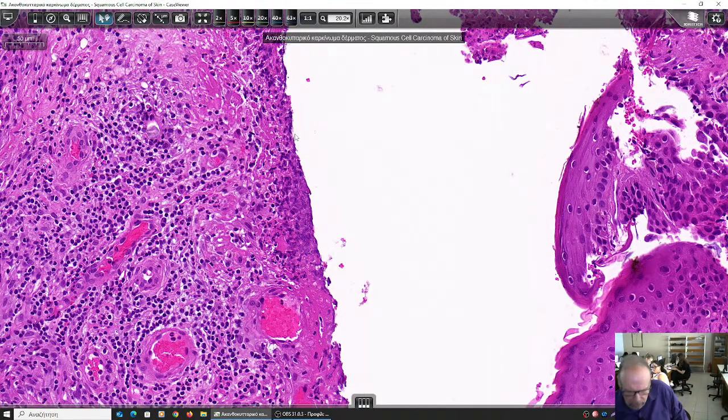How is this called? How did we call this from our lessons on inflammation? We have a destruction of a covering epithelium and its replacement by this, I would say, some sort of pus, an exudate. How do we call that? Then?